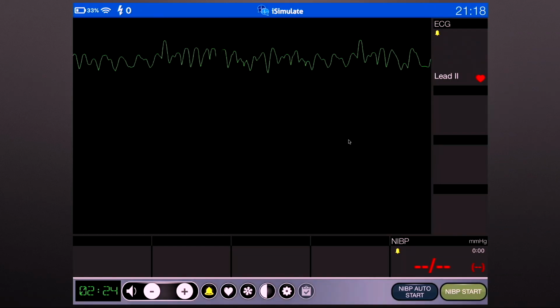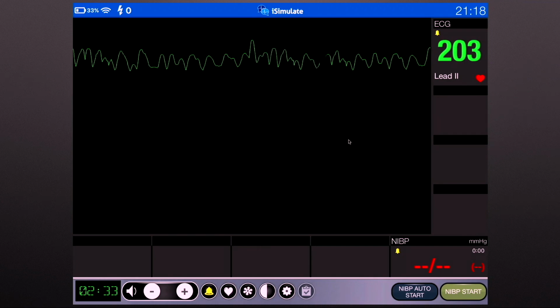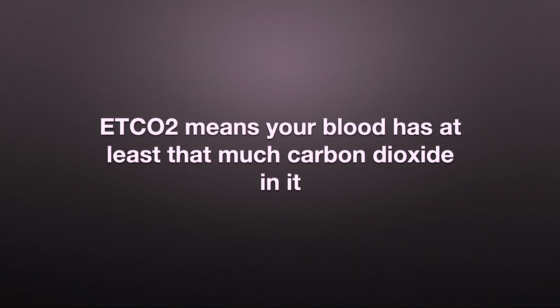The problem is that if you slow this guy's respiratory rate down to 10, all of a sudden his pH goes from, say, 7.01 down to 6.5 because he's no longer able to blow off that CO2. Acid rises, and then he goes into VF and he dies. And that's very hard to get back once you actually get the person into arrest themselves, almost unrecoverable.